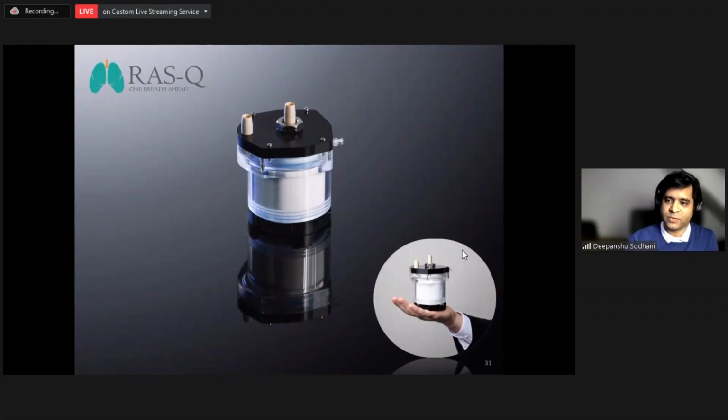Again, over here, the limitation really comes from the fibers at hand. The PMP fibers are really fragile, and bending them over large surfaces can often result in their breakage, and then plasma leakage can occur. That's the reason you see traditional shapes, the square or the layered or the wound oxygenators. It's a limitation that comes from the PMP fibers. If we are able to have fibers which are bendable and still do not destroy themselves, then yes, we could definitely consider other designs for the oxygenators.